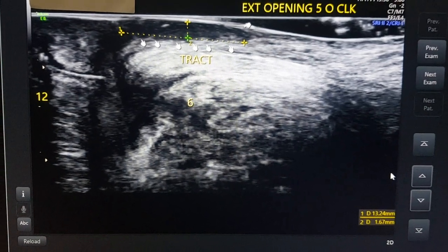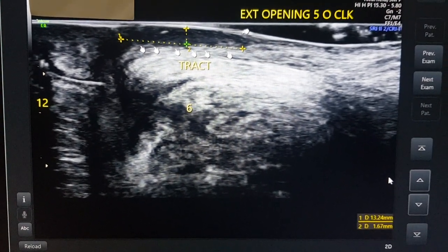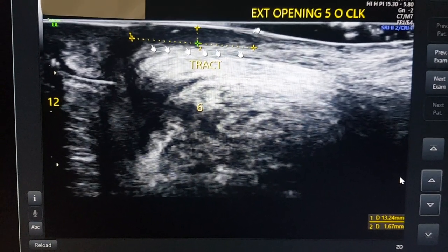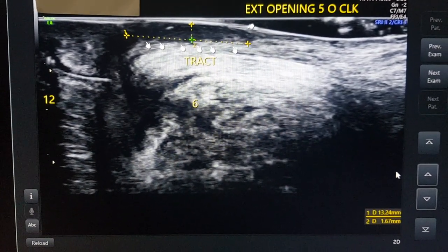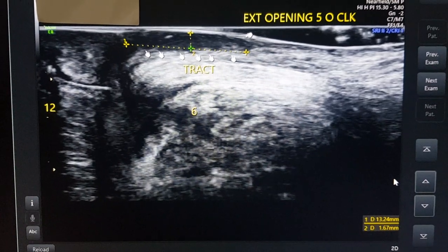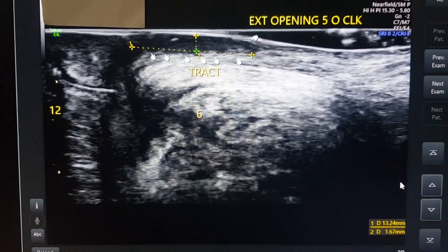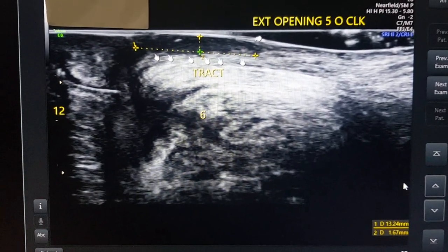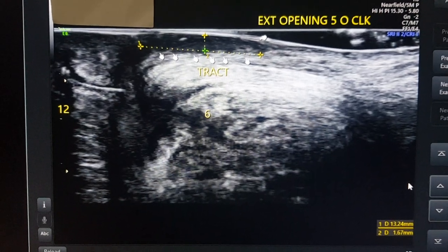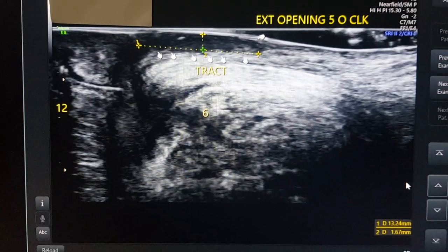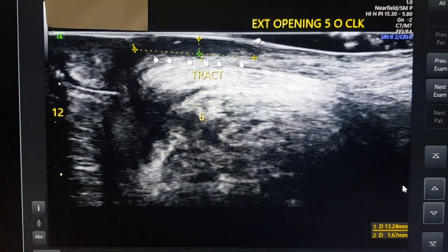Good morning everybody, welcome back to the RAFA series. RAFA stands for Radiology Education for Enhancement of Radiologists. Today we are going to look at transrectal imaging of a case of fistula. I have taken a linear probe and placed it on the sagittal axis over the anal canal and lower perineum.